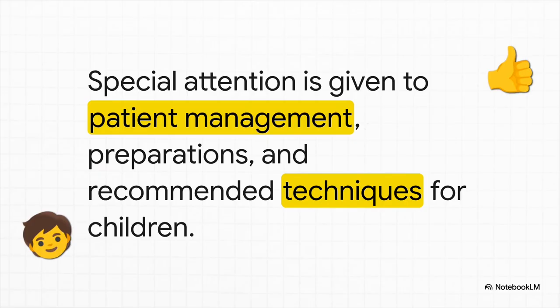Now, when it comes to kids, that's a whole different ballgame. Patient management is everything. We're talking about using kid-friendly language, showing them what's going to happen on a doll first, and of course, using equipment that's actually sized for their smaller mouths. It's all about making it a positive experience from the start.